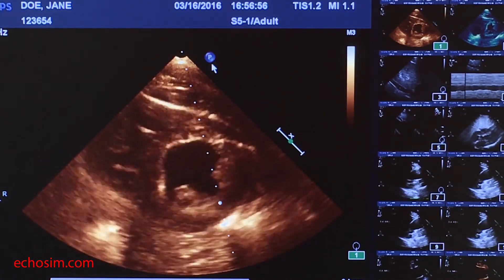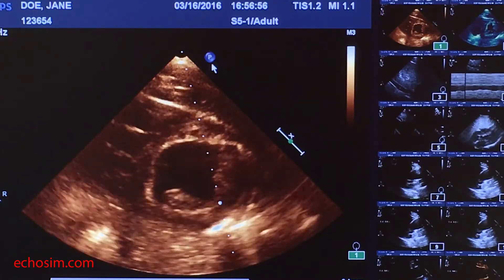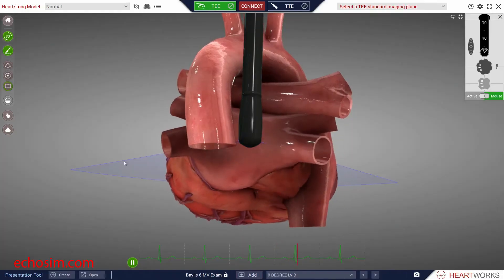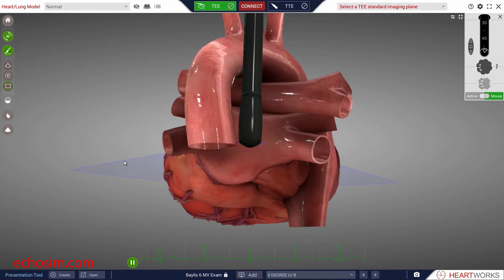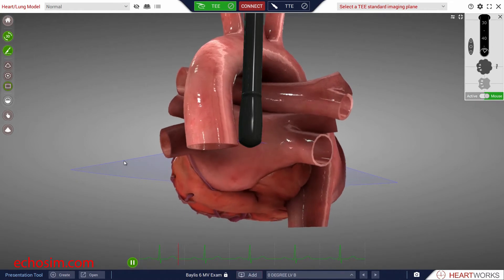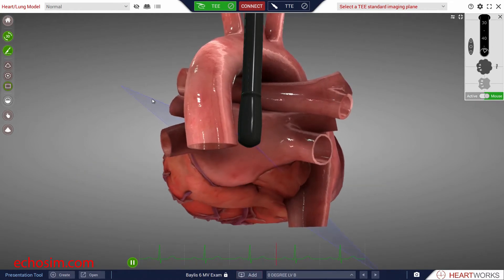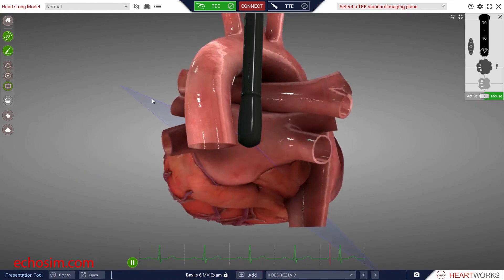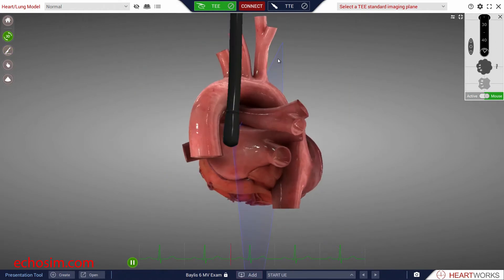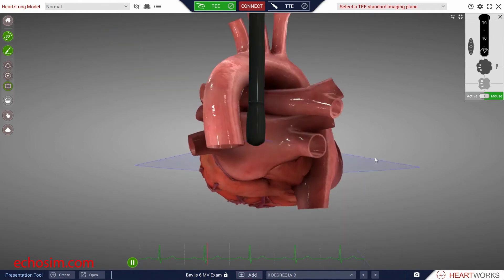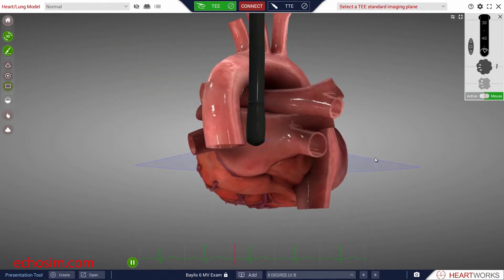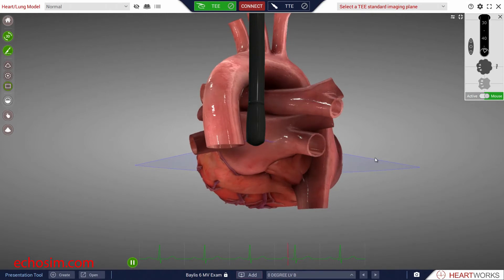This side of the omniplane will always correspond to the blue P marker on the machine display monitor. This will be true regardless of the position of the omniplane, whether it be at 0, 60, 90, 120, or 180 degrees. This will always hold true.